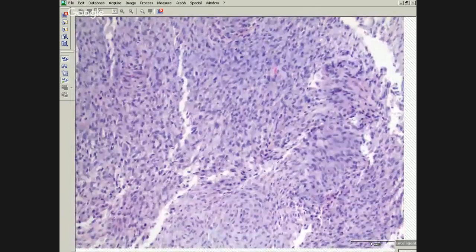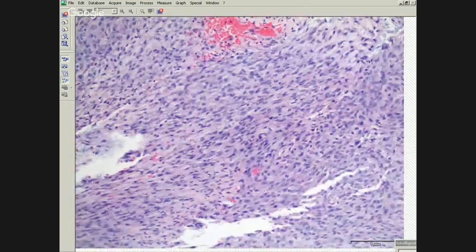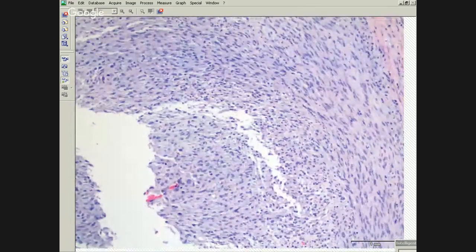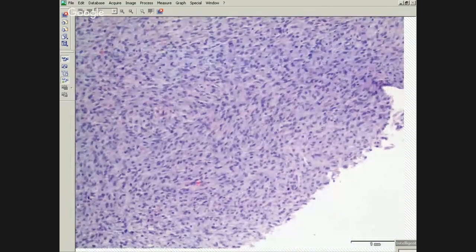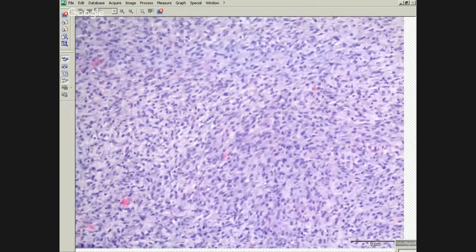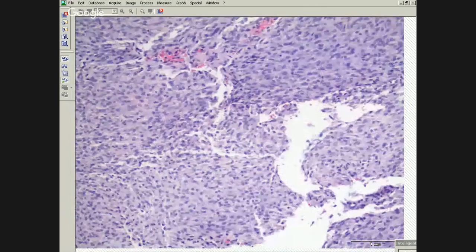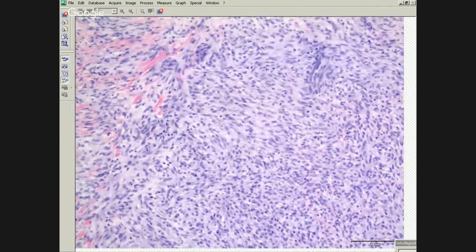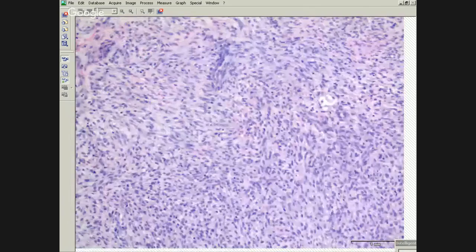So what do we do? Actin. What about actin? Okay, actin was negative. So it can still be a melanoma, but you said HMB45 is negative. Right, but this is a spindle cell one. So remember, the spindle cell ones don't always stain for HMB45 the same as the epithelioid ones. S100 is off the charts positive on this. Then melanoma still. Still it can be melanoma. We can pretend it's positive if you want.